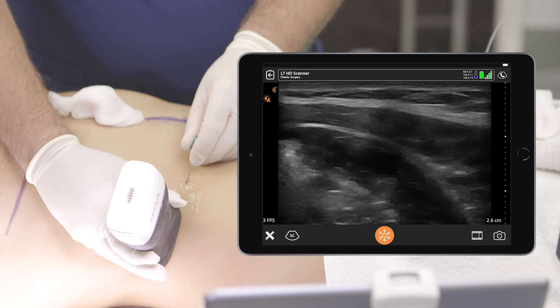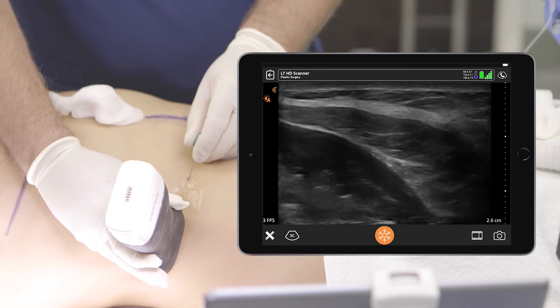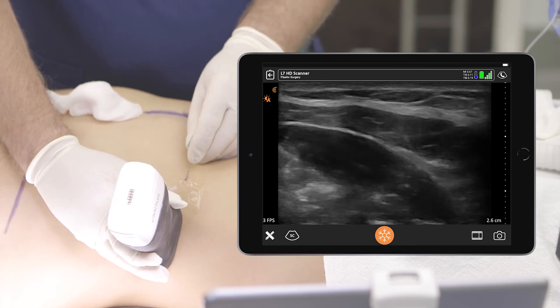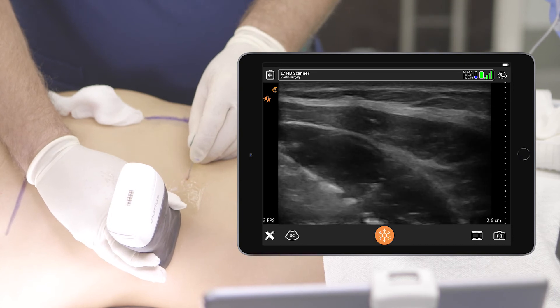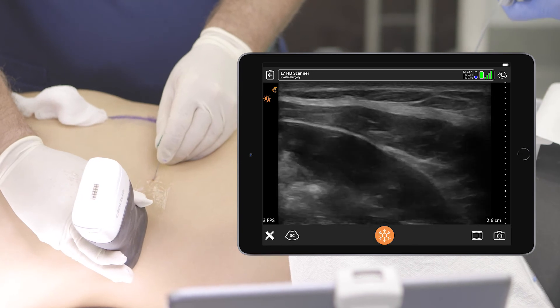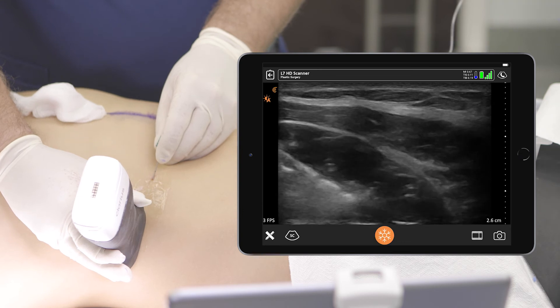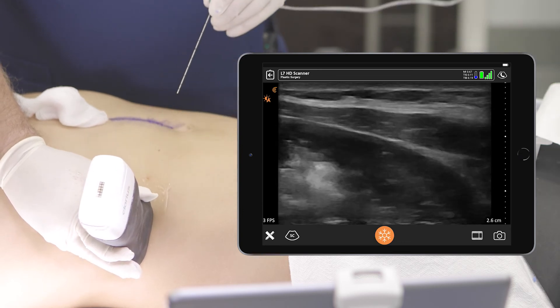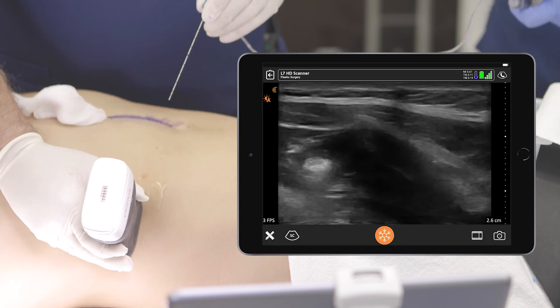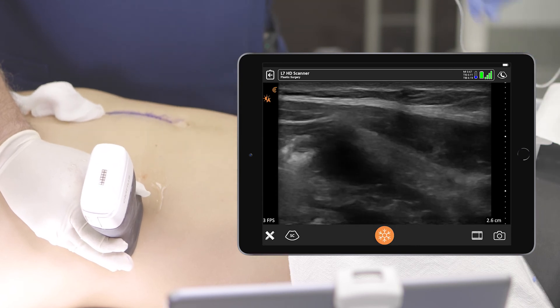You can see the muscles just spreading — yeah, the fish mouth. And there's the needle sitting right in that plane. I'm wiggling it so you can see it on the video. See the internal oblique being split, and then there's the transversalis below, and all the medication sitting right between the muscles. So that's exactly what we want to see.